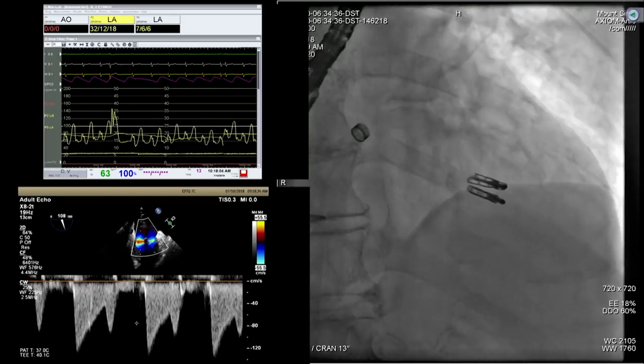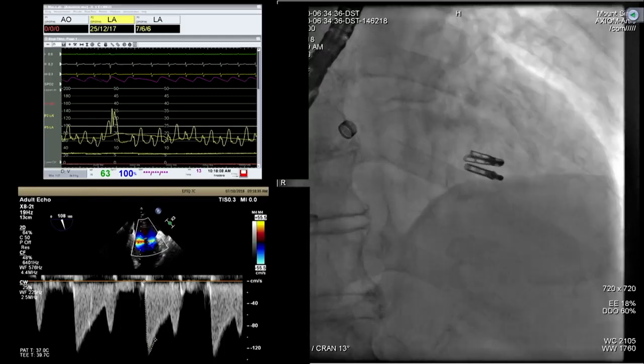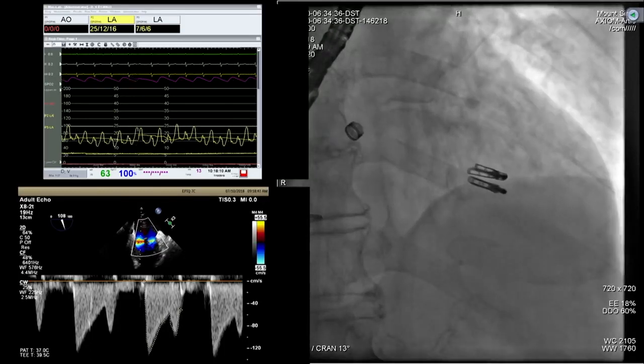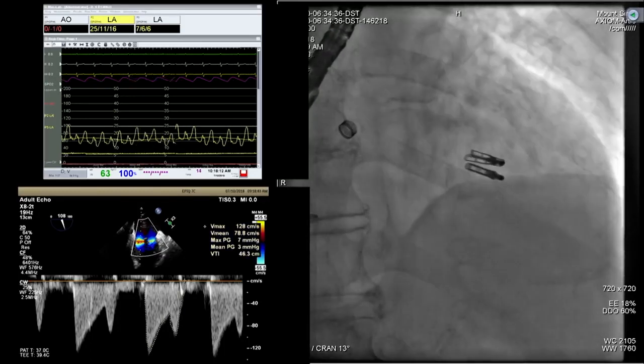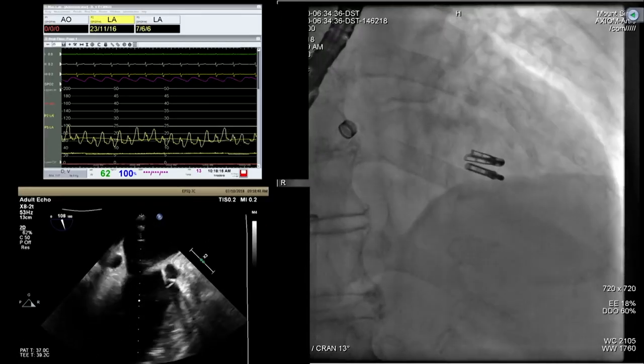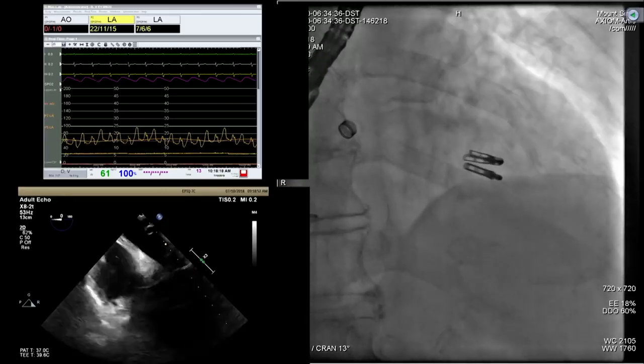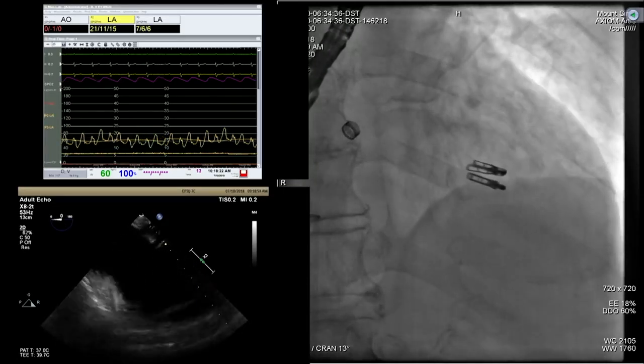Oh, okay. I'm going to look. So this is the final V wave. You see the V waves? Just about 35? Okay. I can say between about 20, right? Yeah. Did you get some significant reduction? Yeah. Because they're freaking out, you know.